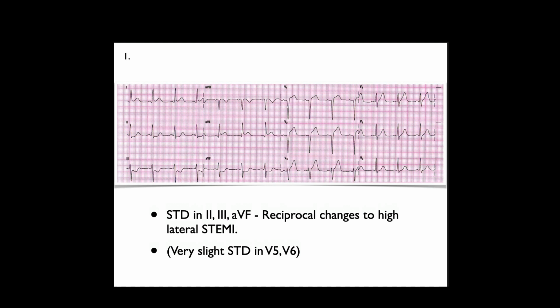No trouble at all, because the T-wave's flat. There's definite ST elevation in AVL, maybe half a box in 1, and I know we're supposed to have contiguous 1 millimeter, but combined with this very dramatic ST depression, I would have no trouble calling that. There also happens to be a septal anterior STEMI, so you're kind of off the hook in terms of a STEMI alert, but I think the inferior is definitely there.